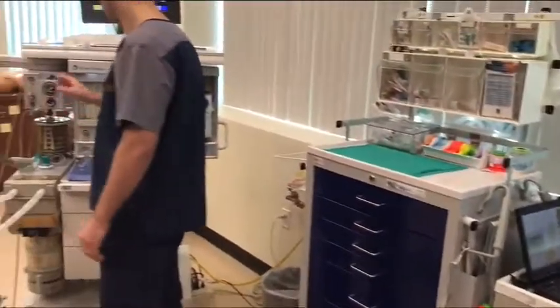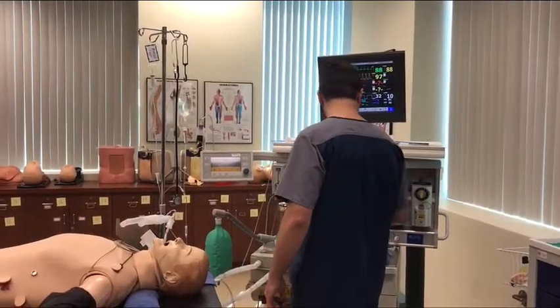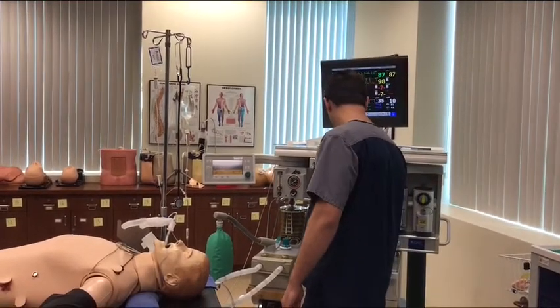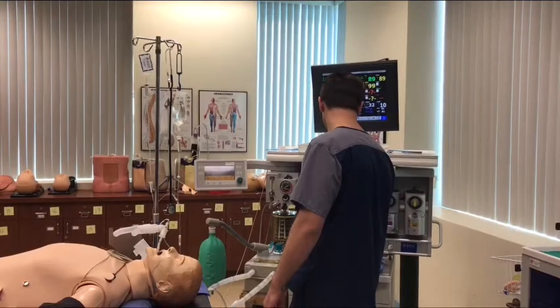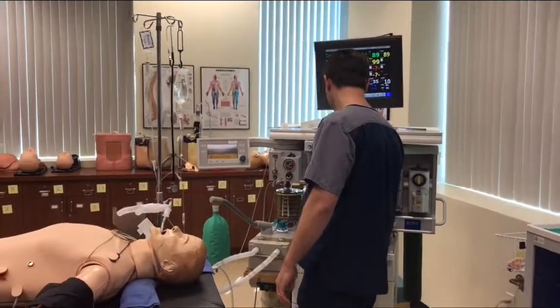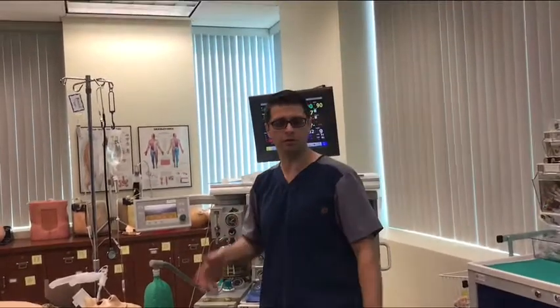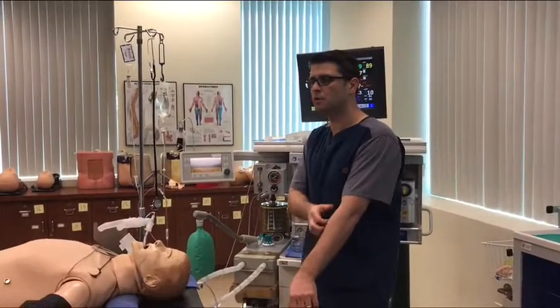What are the things he's going to be doing? He said turn the gas off. No, don't turn the gas off. Turn the O2 high, my gas loads, and make sure that he's blowing off all that. Well, you're blowing it off for him. I'm blowing off. Right.